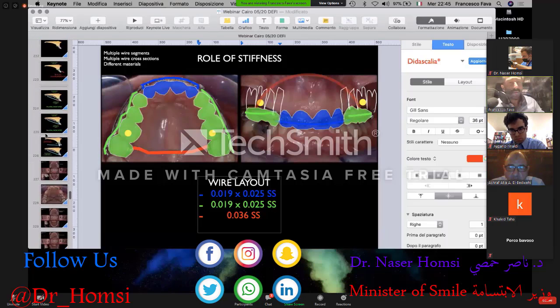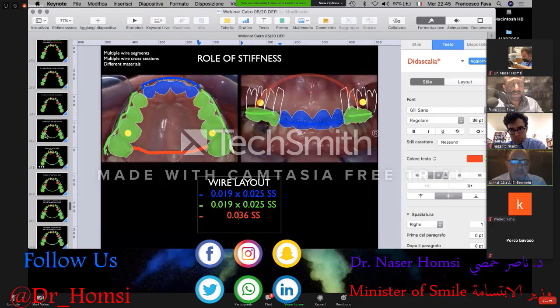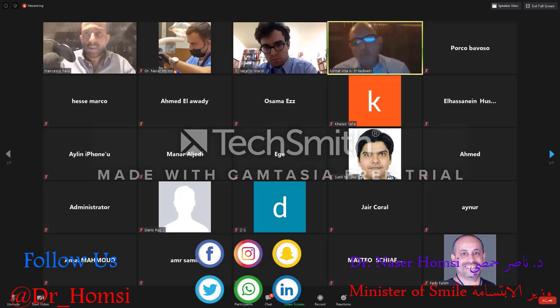In the first case or the last case? No, he considered a case of medium diastema with extrusion of the upper incisors, and he wanted to intrude them during closure of space. He asked, is it possible to use a mini screw with segmented arch with power arm to intrude during the closure of space?